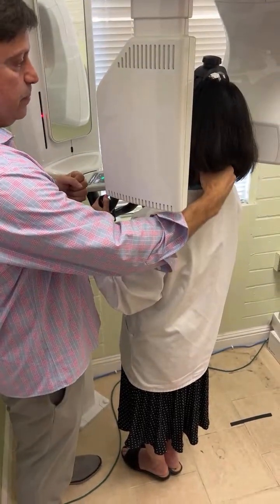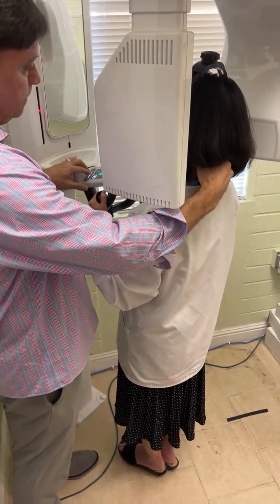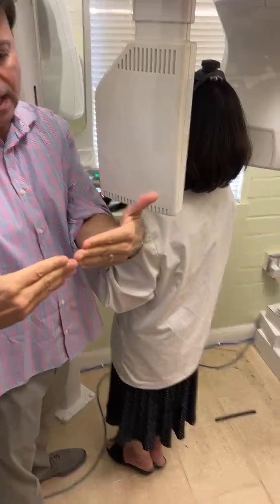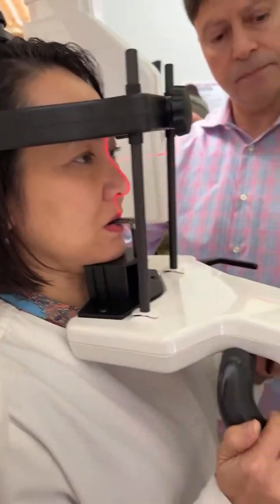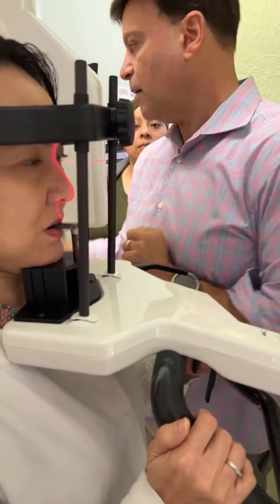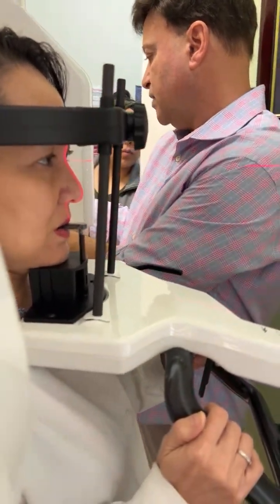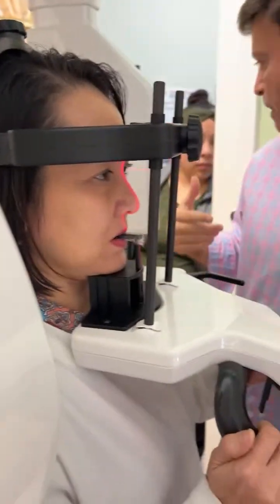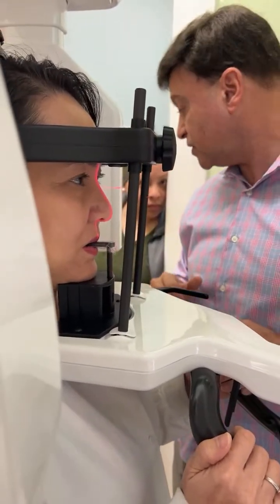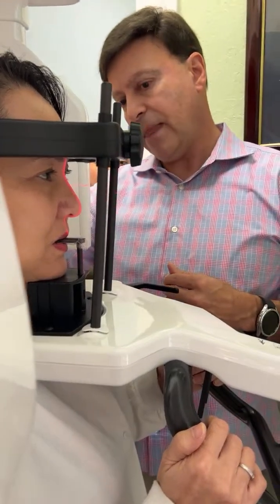So what I want to do is stretch her up and then gently lower the machine. Because right now, if I were to take it right now, I am going to get a flat image for sure. I just want her profile coming forward. It's pretty subtle. So right now it's not there yet. That may be a little bit too much. See, she's starting to come forward now. Her chin is starting to come forward, her face, and now if we took it, we would get something like that. So come over here and look. You can see that she's not straight up and down anymore, and she's not too far forward. That's about right. It's very subtle. That's about all you want from that.